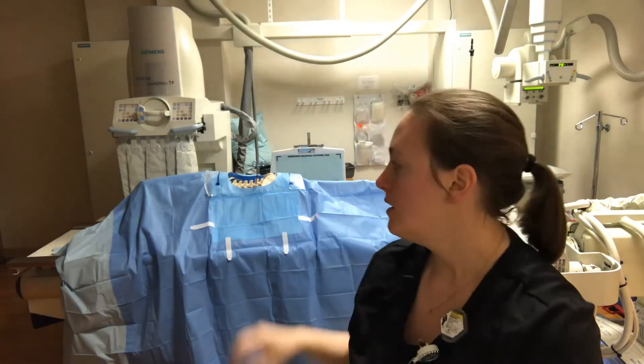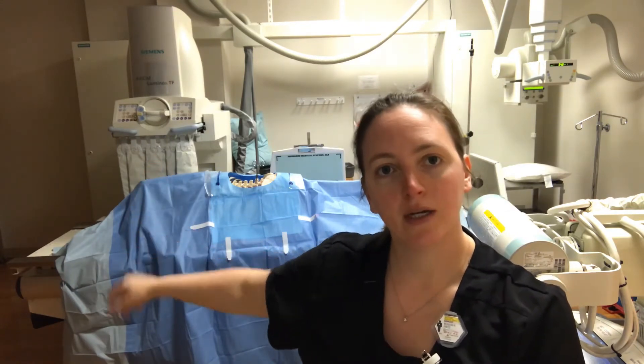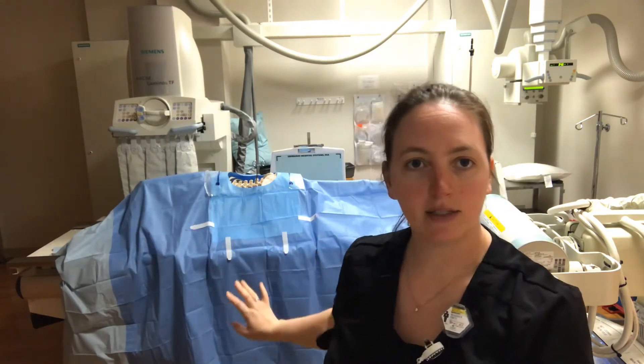For shoot through lumbar spine, which we do most often, the patient will be prone on the table. Anesthesia will be at the head of the patient. The surgeon may be on this side.